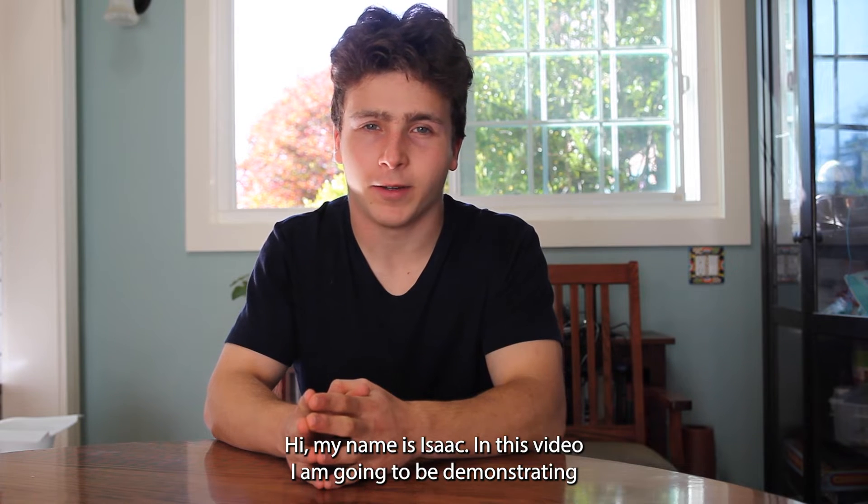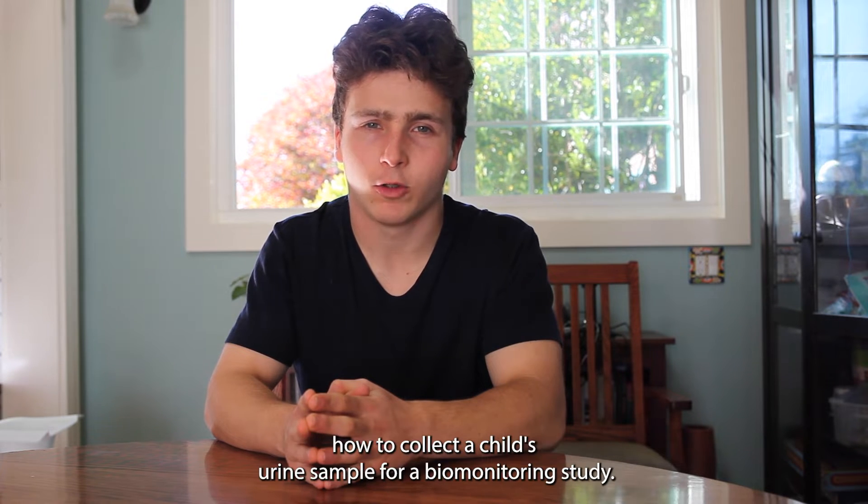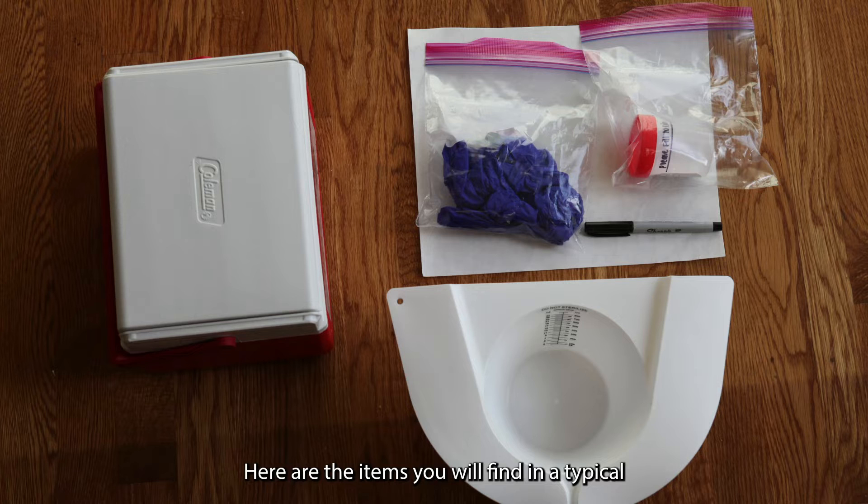Hi, my name is Isaac and in this video I'm going to be demonstrating how to collect a child's urine sample for a biomonitoring study. Here are the items you will find in a typical urine sample collection kit.